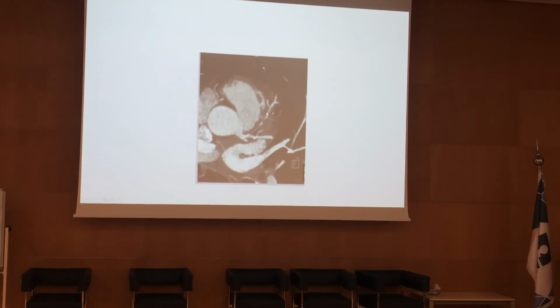And what's this? So the left main gives 2 main branches, LAD. Okay, so LAD, left anterior descending artery. What do you see here? This LAD, it's occluded LAD disease. So it should be like this. So this is an occluded LAD. The proximal LAD is occluded till the first branch, which is the diagonal branch.